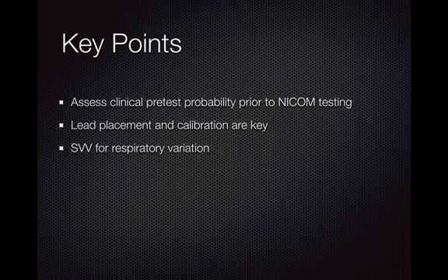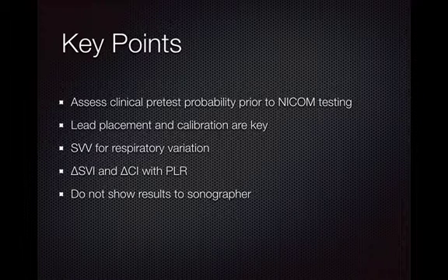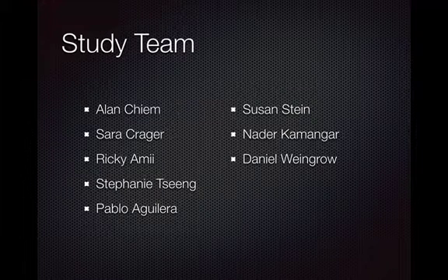We didn't talk much about this, but the stroke volume variation, which is reported by the NICOM, is how we're going to see if they're fluid responsive based on respiratory variability. For measures that rely on the passive leg raise protocol, we're going to look at the delta stroke volume and delta cardiac output or index. Remember, if you're manning the NICOM, don't show your results to the sonographer because you don't want to bias the sonographer. And last, these are the members of the study team.